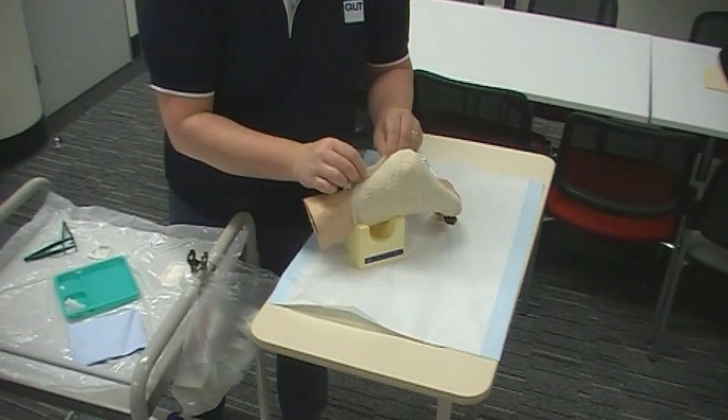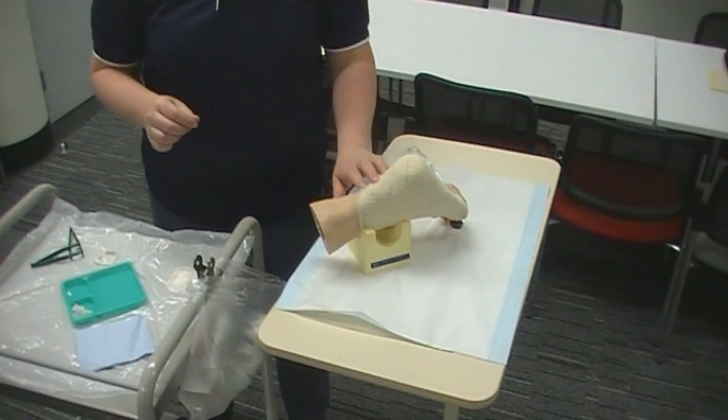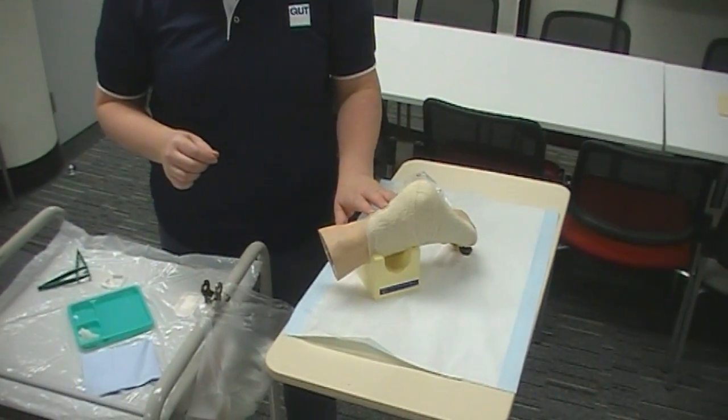And we're all done. Just make sure in a little while that it's not too tight for the patient — if it is, we'll need to loosen it off.